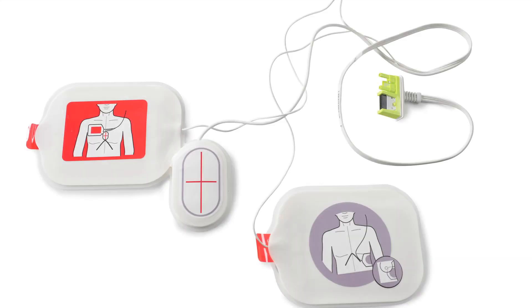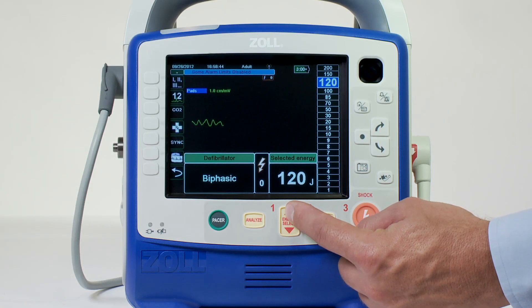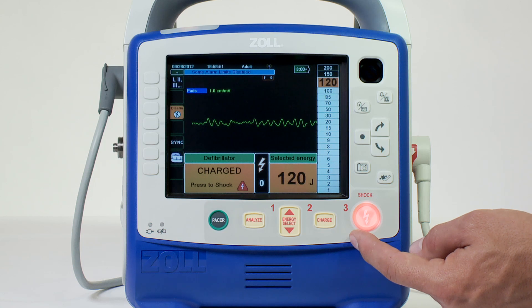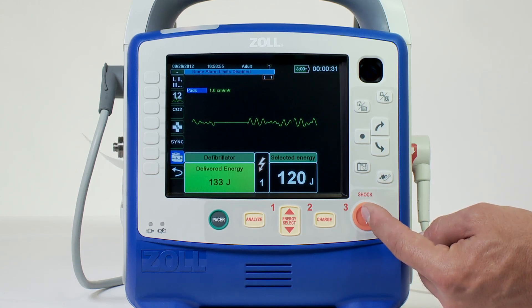To defibrillate with pads, attach them to the patient according to instructions on the packaging. Press the select energy arrows indicated with a 1 up or down to select the desired energy level. Press the charge button indicated with a 2, and then press the shock button indicated with a 3 until energy is delivered to the patient.